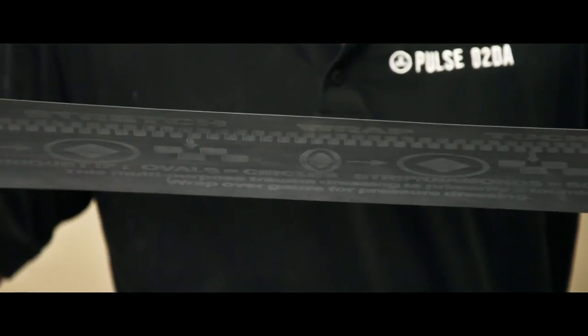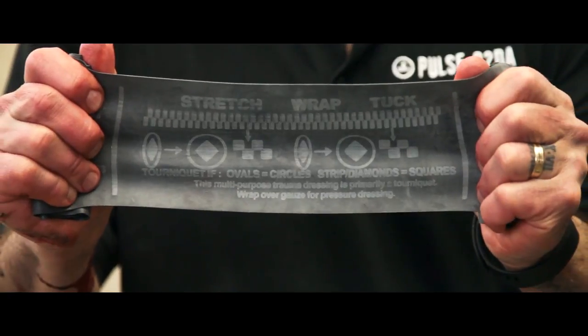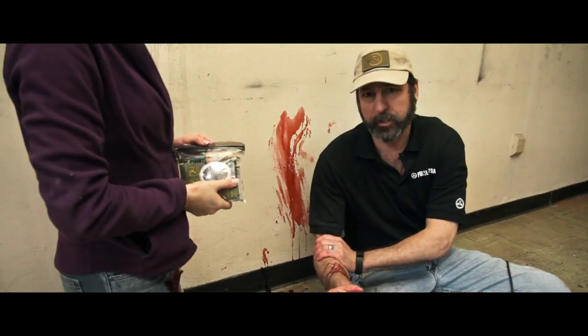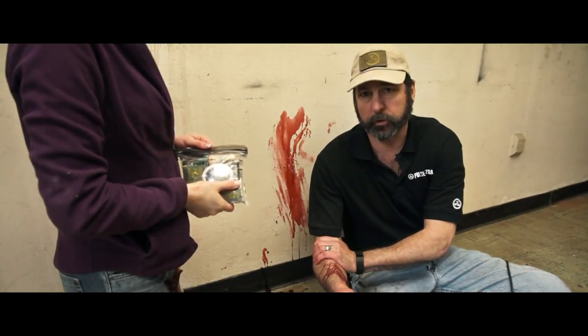We're going to demonstrate the SWAT tourniquet. SWAT stands for Stretch, Wrap, and Tuck. The tourniquet is essentially a large rubber band that can be put in place. It has indicators on the outside that allow you to determine how much tension is placed.